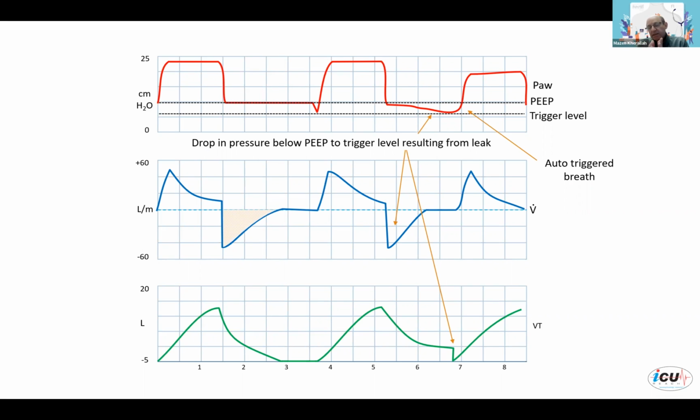And that's why I said the important thing you do with the management is to decrease the inspiratory time. You need to minimize the time where the volume is in. Now, does it mean that I would just adjust the tidal volume after subtracting the leaked volume? No.